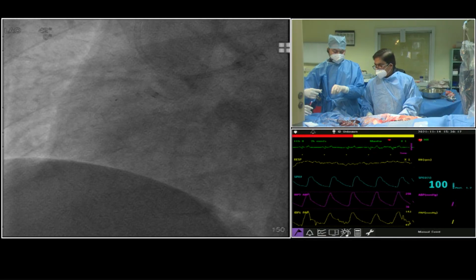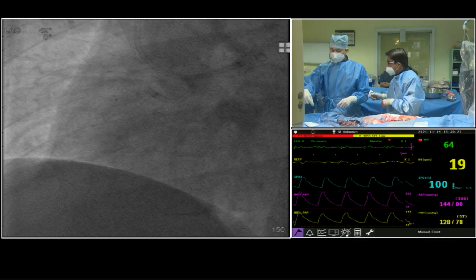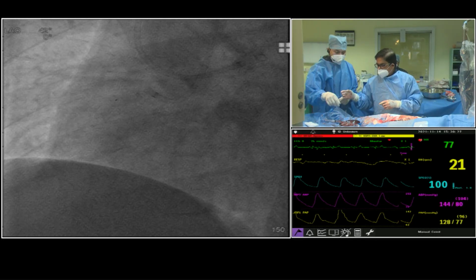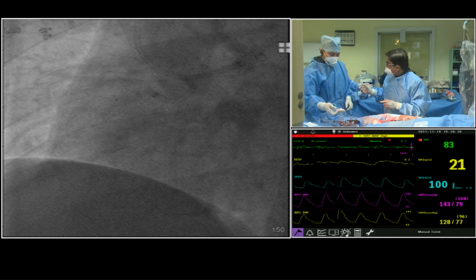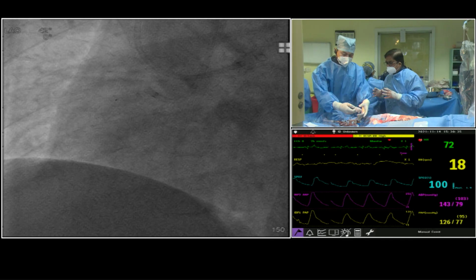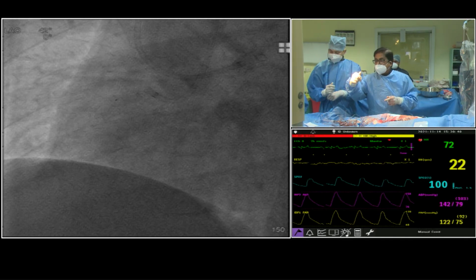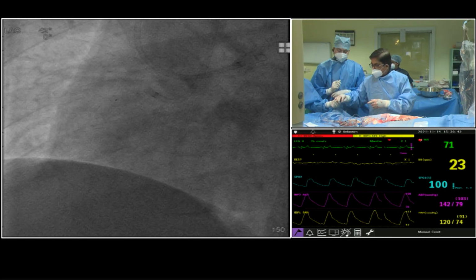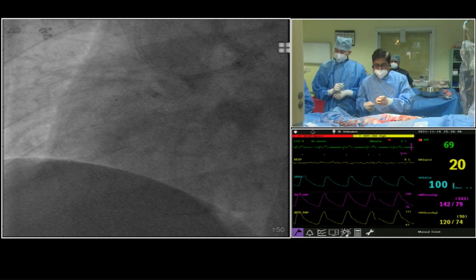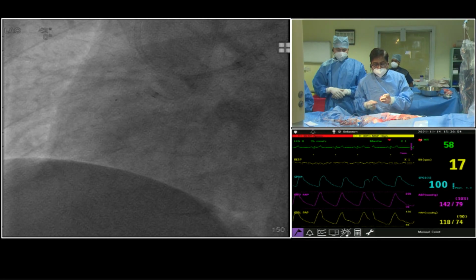Give me a septal channel. XTR or something. Come on. At this stage, my choice would have been an XT plane, because XT is a Fine Cross. I put the Fine Cross there. Give me an XTR. I think they don't have an XT. I love to use an XT because you can't direct it, but it finds its way when the lesion is soft. I am sure this part is soft, so I would have preferred it. You'll be taking an XTA, right? Not XTA. I'm using an XTR because this is a soft lesion here, if I'm not wrong.